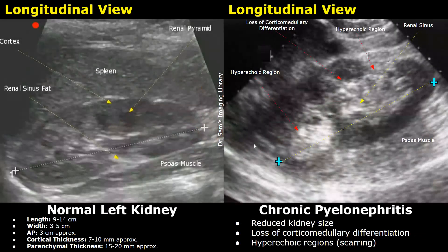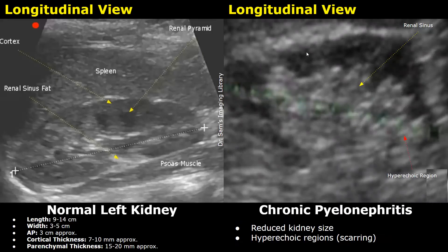In chronic cases of pyelonephritis, the kidney may shrink — its size may be reduced. This kidney measured seven centimeters in length. Loss of corticomedullary differentiation is noted, and there are some hyperechoic regions indicating scarring. In another case of chronic pyelonephritis, the kidney appears smaller than normal with many hyperechoic regions indicating scarring, and the cortex appears thin. CT scan is often better than ultrasound for diagnosing pyelonephritis.